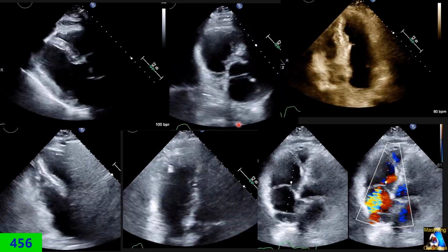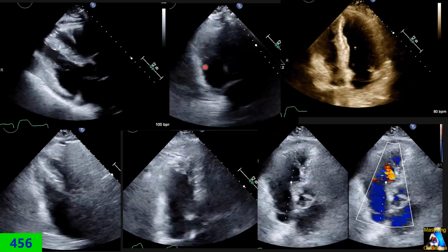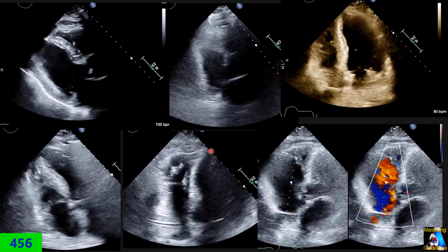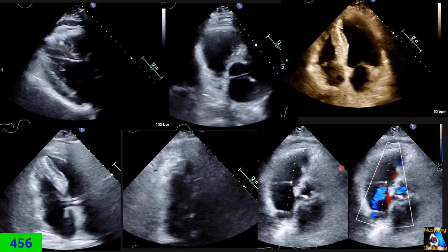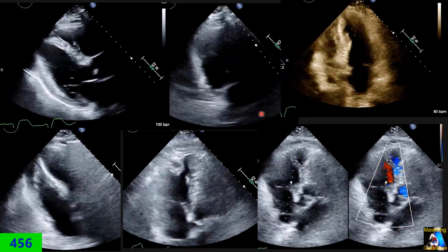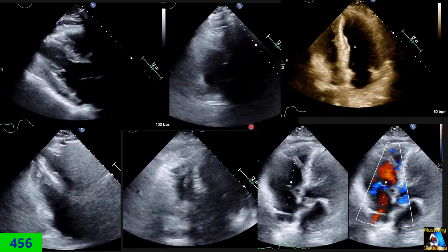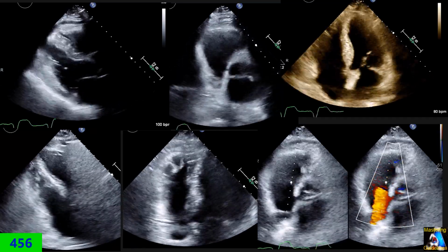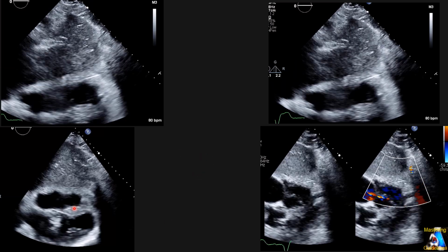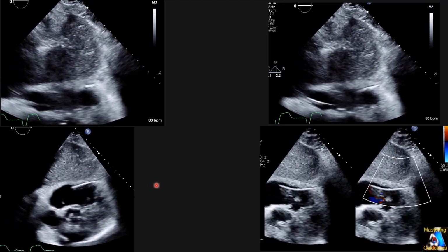For a temporary pacemaker that has one lead and is small, and we don't anchor it, we just fix it at the contact to the apex, the subcostal view is useful. If we couldn't see it in any of those parasternal or apical windows, off axis, anything, we have to go and search within the subcostal. Here in the subcostal view, we could check the lead and see what is going on.